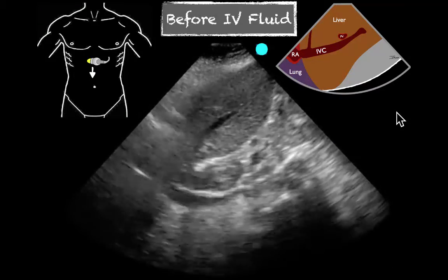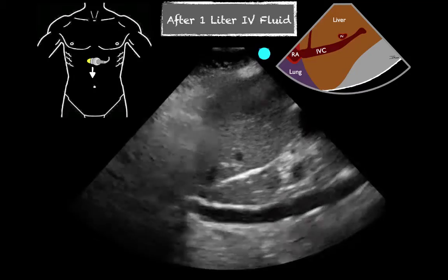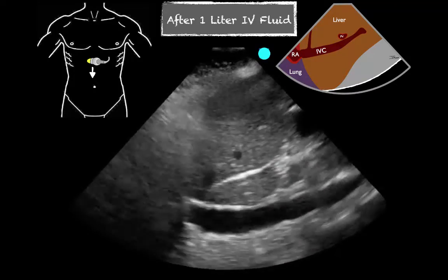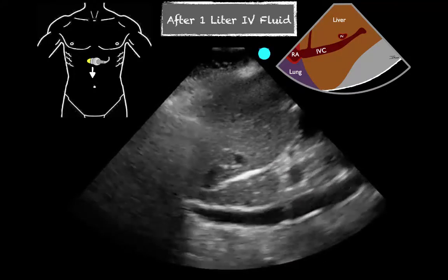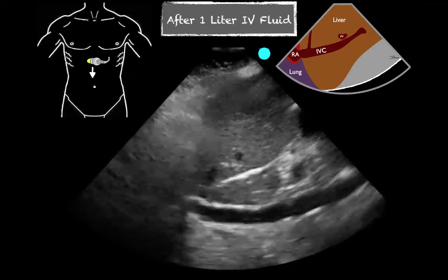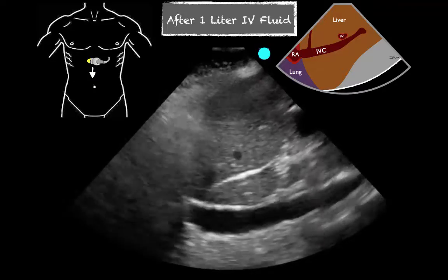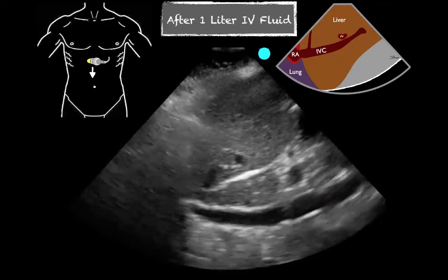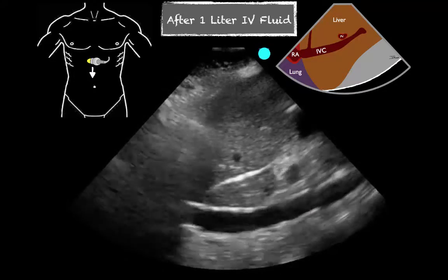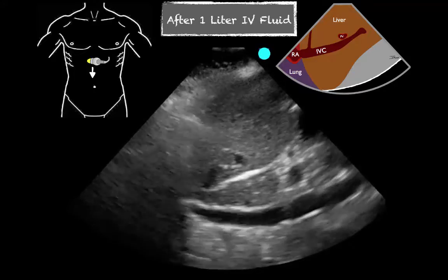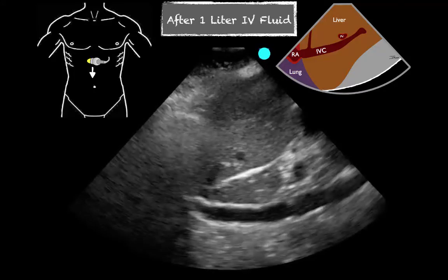After a liter of fluids, that's what the IVC began to look like — it was more distended, still had some variability. The blood pressure on this patient improved after that first liter of fluids, and then a second liter of fluids was given.